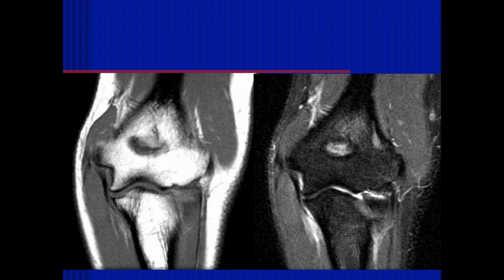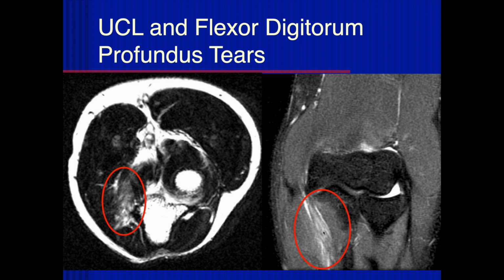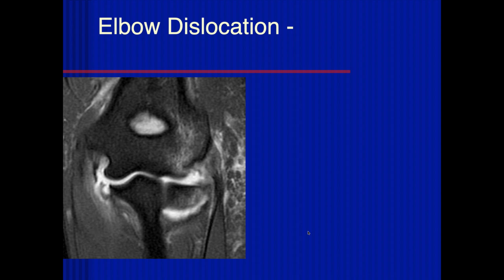We see a little eburnation at the sublime tubercle. So this patient looks like they have chronic overuse and now a tear distally. There's probably some extravasation of fluid from the joint space through the tear into the muscles here, but the patient could also have a muscle tear in addition. This was an ulnar collateral ligament and a flexor digitorum profundus tear. Okay, Michael.